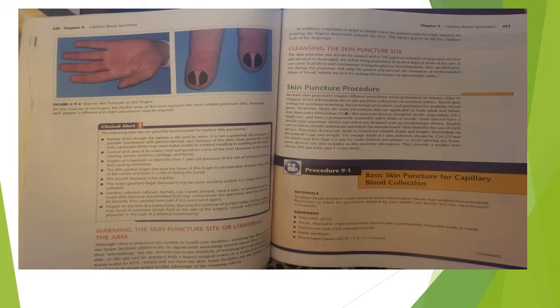Cleansing the skin puncture site. The skin puncture site should be cleaned with 70% aqueous solution of isopropyl alcohol and allowed to thoroughly dry before being punctured. If alcohol drips or pools at the site, it can cause hemolysis and contaminate tests for glucose determinations. Also, alcohol present during the puncture will sting the patient and prevent the formation of well-rounded drops of blood, which are best for making blood smears on microscopic slides.